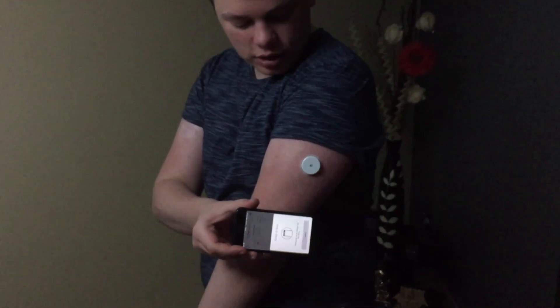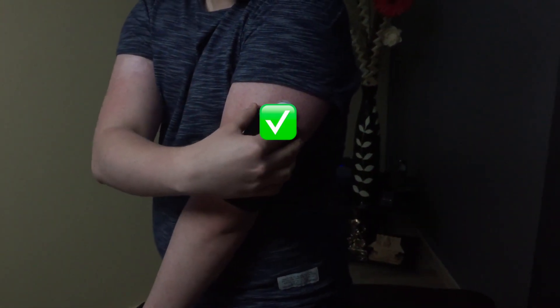One thing to point out about iPhone scanning: it looks fantastic, but the way the NFC antenna is built into the iPhone, it can be tricky at first — though after a couple of days you will get used to it. With the reader, the NFC antenna is built exactly in the middle, so you can just swipe and get your reading. But with the iPhone, the antenna is at the very top, and sometimes you need to angle it as well for it to scan properly. So make sure the very top of the iPhone is touching your Freestyle Libre sensor.